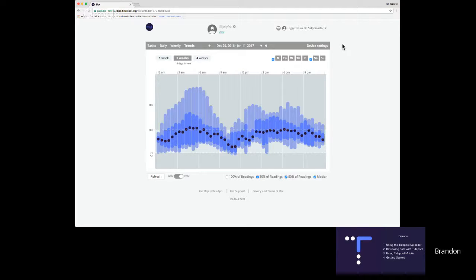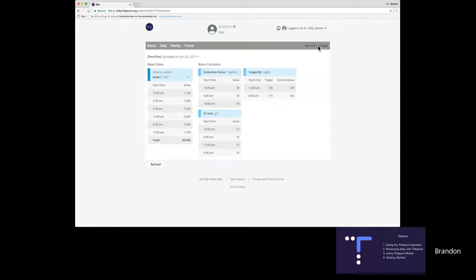The last thing I want to show you in Tidepool Web is device settings. This shows all of Jill's pump settings in one place at one time. This view is standardized, so regardless of what pump Jill is using, the device settings look the same — you don't have to acclimate yourself to different views. This is true of all of Tidepool's screens: all the data comes together, and regardless of which devices your patient is using, the data analysis is consistent and easy for you.